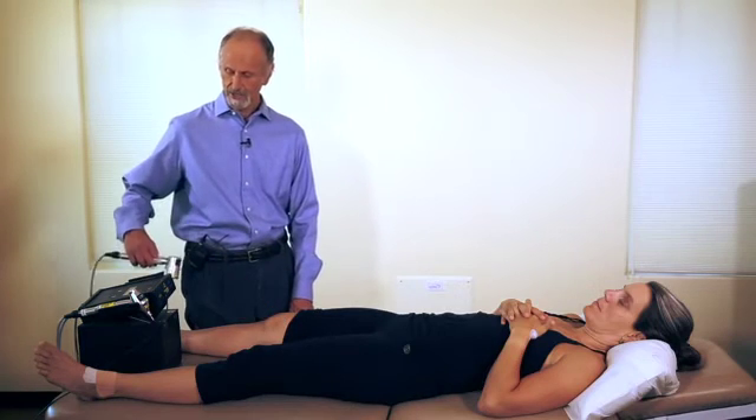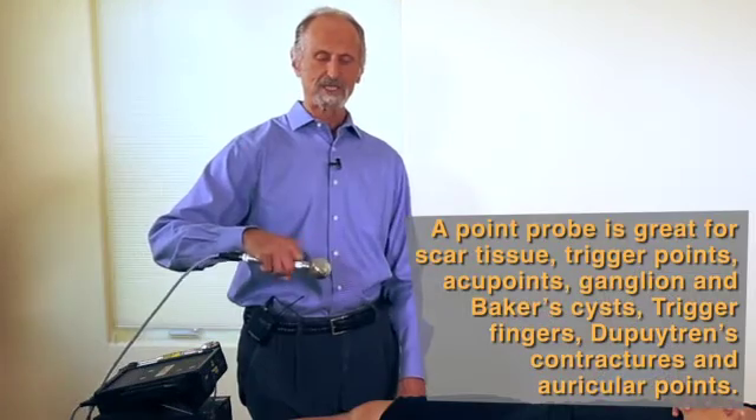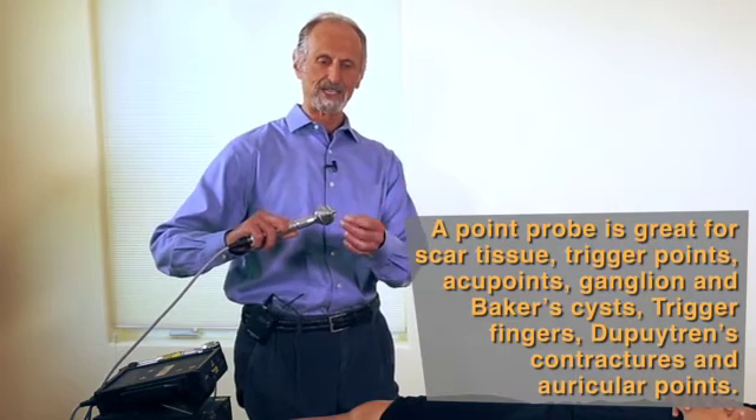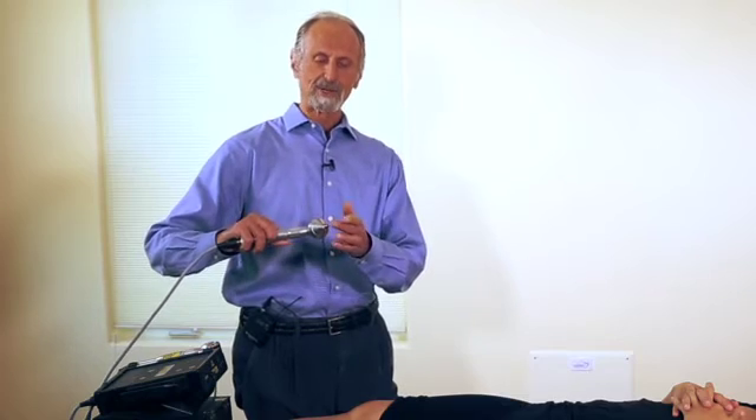The other thing you can do with a laser like this is use a point probe. This kind of laser is very powerful in terms of power density because you have a lot of power — like 500 to 700 milliwatts — in a very small area. That's great for things like ganglion cysts and Baker cysts, where you want to get very deep into the structure and break up scar tissue. That's what we call a point probe.